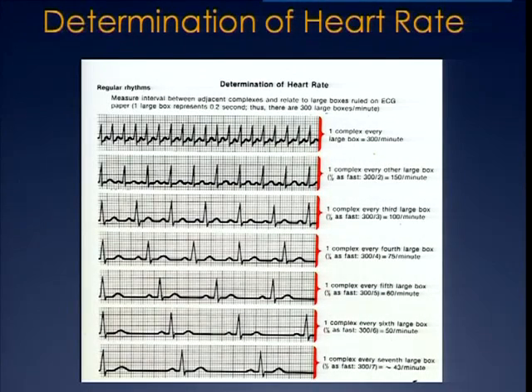One more thing that is very important for postgraduates to understand. Normally when we talk of a pulse, we feel someone's pulse and say someone's heart rate is so and so. But when you look at an ECG, what we are talking about is not just the QRS rate. You have to think in terms of what is the P rate, what is the QRS rate, because that is how you know whether there are blocks or not. It's very important that every P should be followed by a QRS. So the question that you should ask yourself, when you're looking at the rhythm, is there one-to-one conduction?